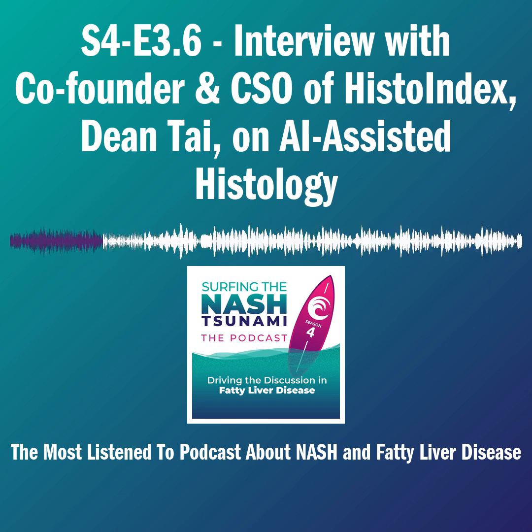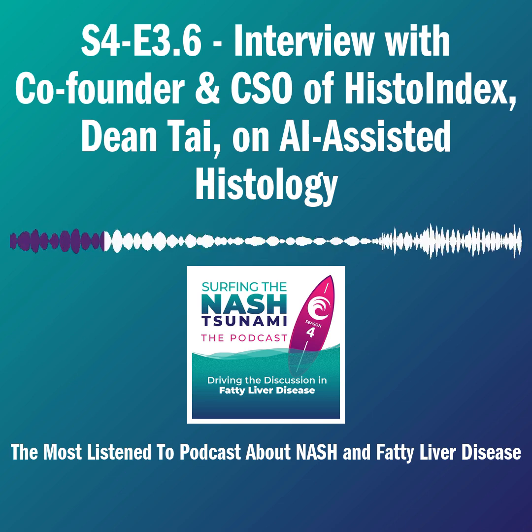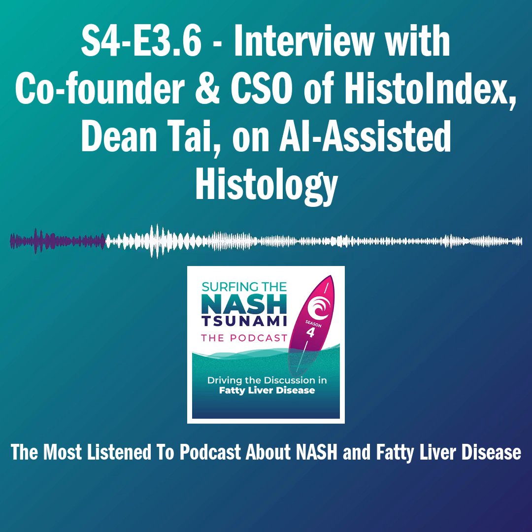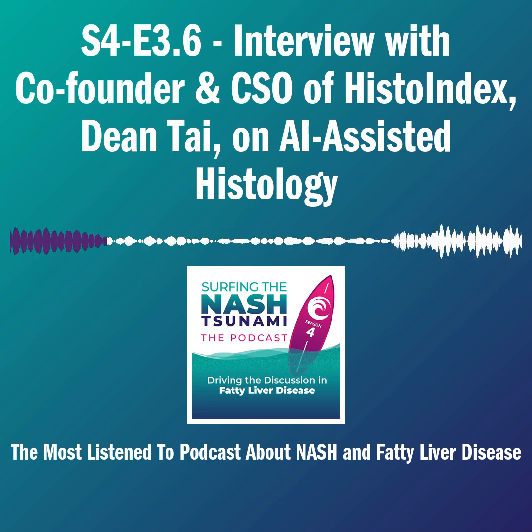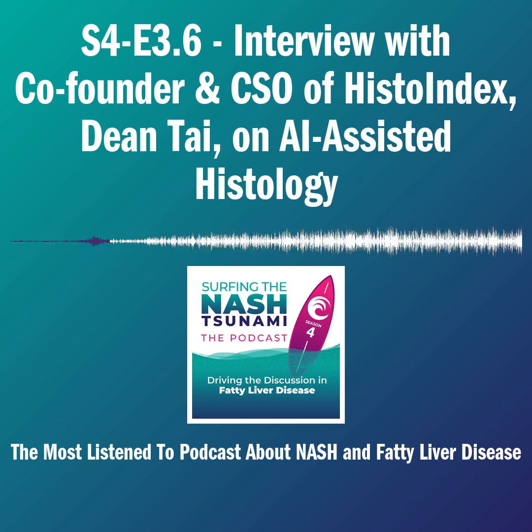I think there's a certain excitement around what you're ready to discuss with us here, because looking back, we've seen some trials with a very short duration, 12 weeks, and very effective defattening of the liver. And something that was reported was relevant fibrosis reduction. Everybody then asked, how can that be? Fibrosis is slowly moving. Is this a true effect? What happens? And I think the point you're making here is that fat reduction changes liver morphology, liver size.